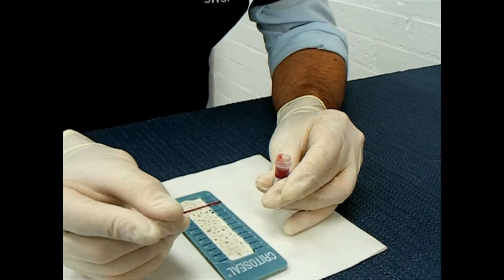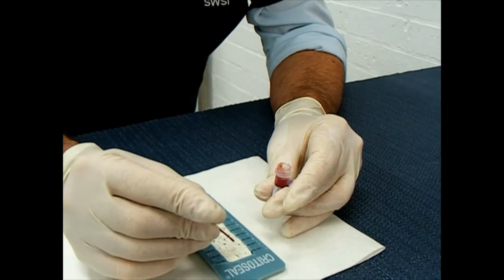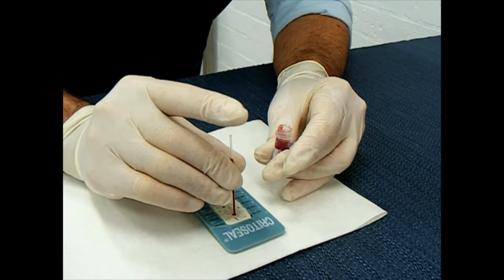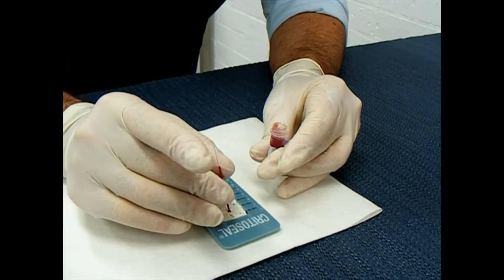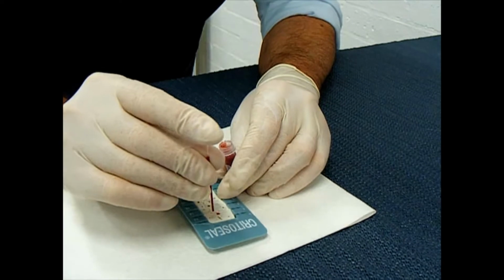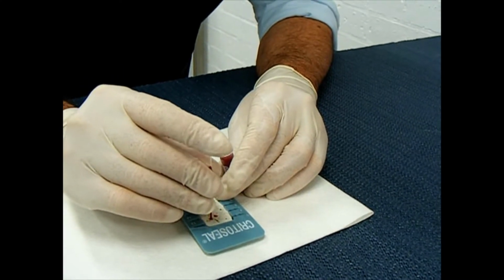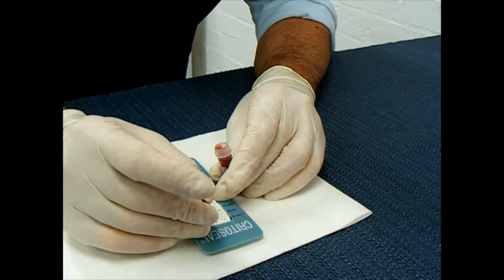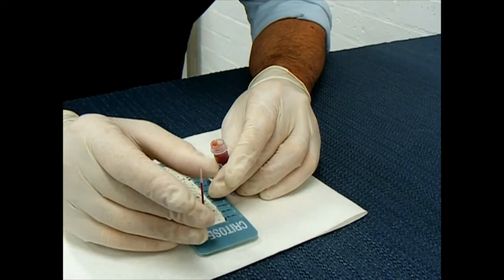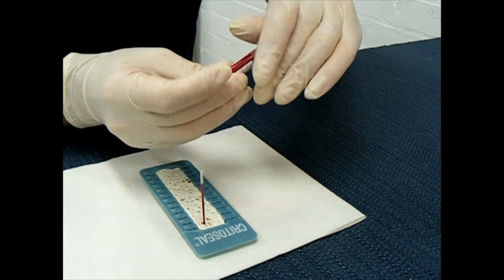I'll show you what I'm going to do. This tube I'm going to put into the plasticine. So I push it into the plasticine like that. I give it a little bit of a twist and a little bit of a turn. I pick it up again with my finger on the top. I push it again into the plasticine, a bit of a twist and a bit of a turn. I pick it up again, I push it in with a bit of a twist and a turn. I am going to get the lid on here.